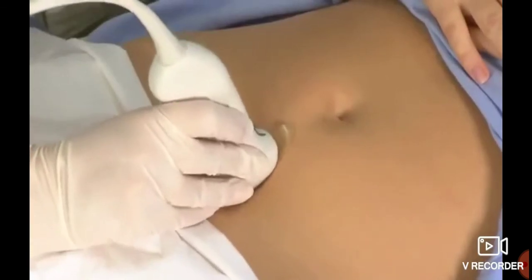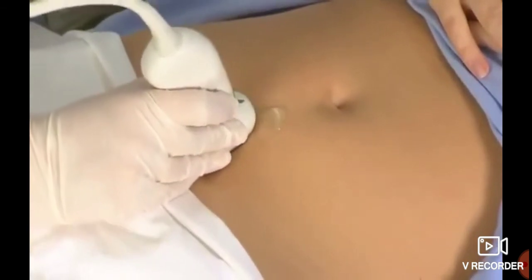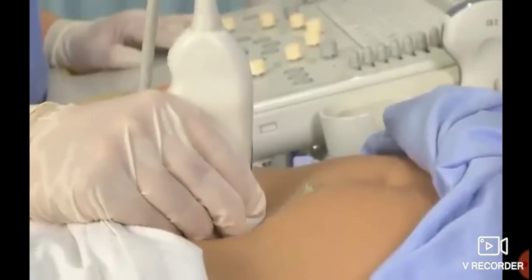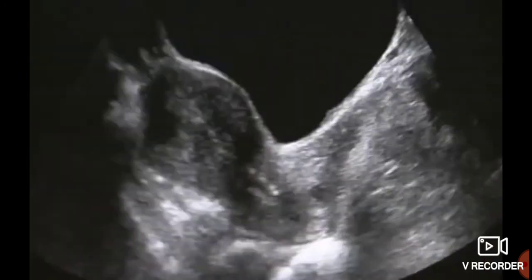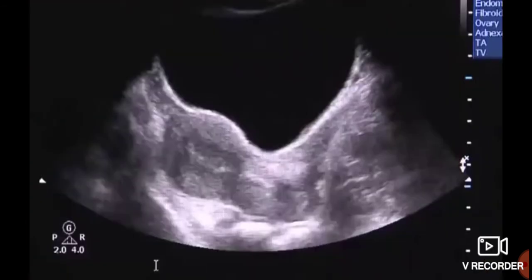Starting with the midline uterine image, manipulate the transducer towards each side in turn and assess the uterus past its margins to the adnexa. Freeze the optimized image of the uterus as required. Annotate as to structure, scan plane, and scan approach.